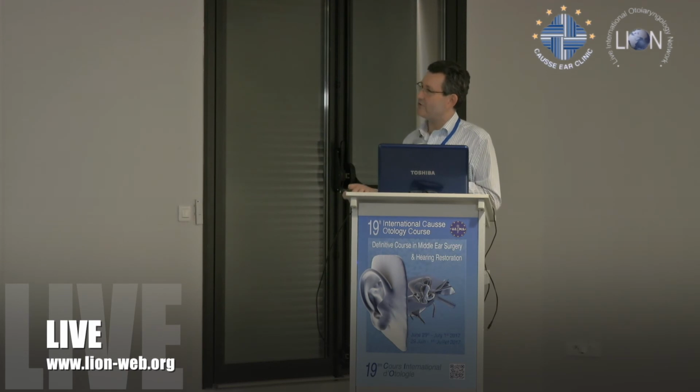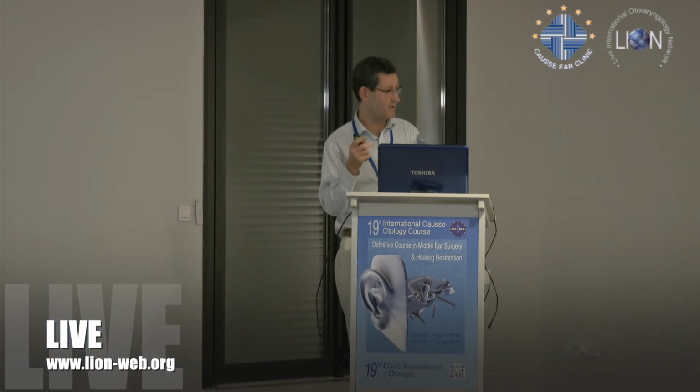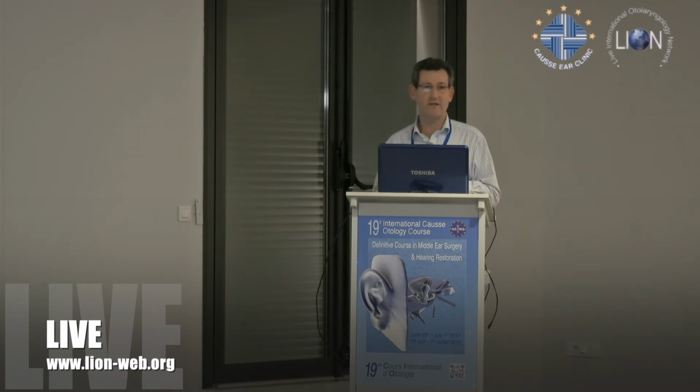But this system, the Carina, is an active middle ear implant. It has a little transducer here that connects to the incus, and this is the subcutaneous microphone. And this system has some built-in noise cancellation. And this has proven very effective. I have a patient again, and he does very well with the Carina, and he's a farmer from up the country in Victoria where I live, and he's in fact got a bone-anchored hearing aid on one ear, a percutaneous Baha, and he's got a Carina in his other ear, and he actually prefers the Carina, which to me is a single subject demonstration that it's relatively effective.